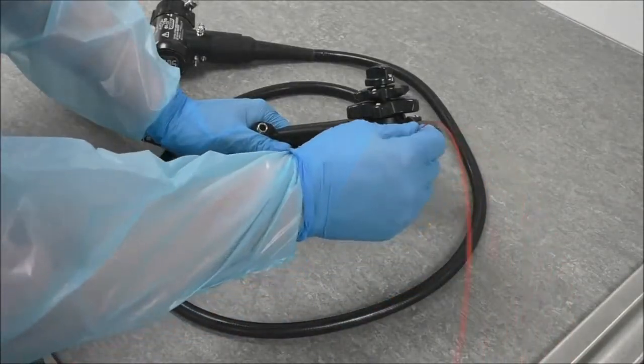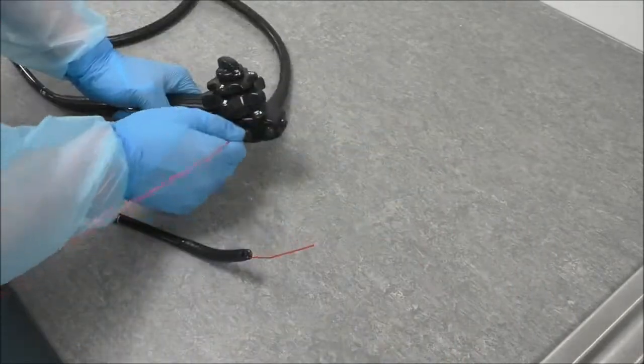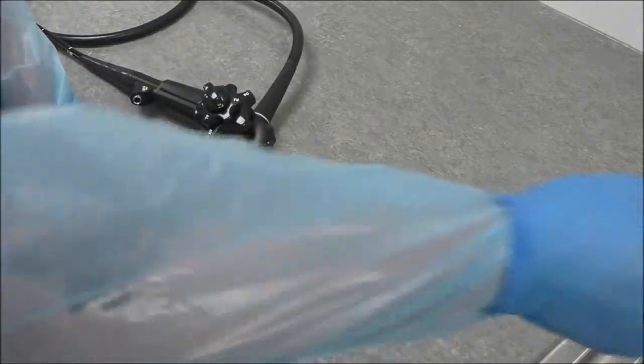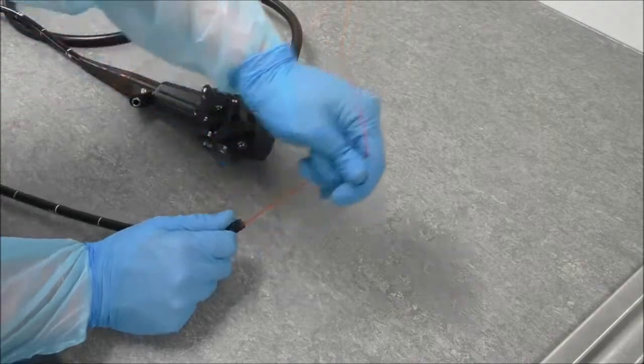Then insert channel cleaning brush at 45-degree angle in suction cylinder so that it goes down the biopsy channel. When brush appears from distal end, pull brush through biopsy channel.